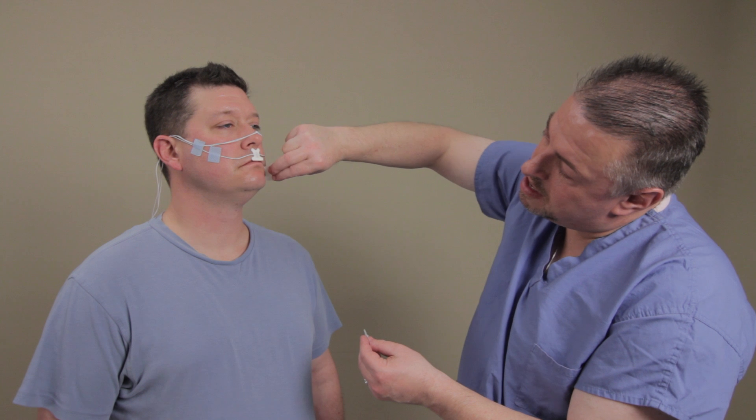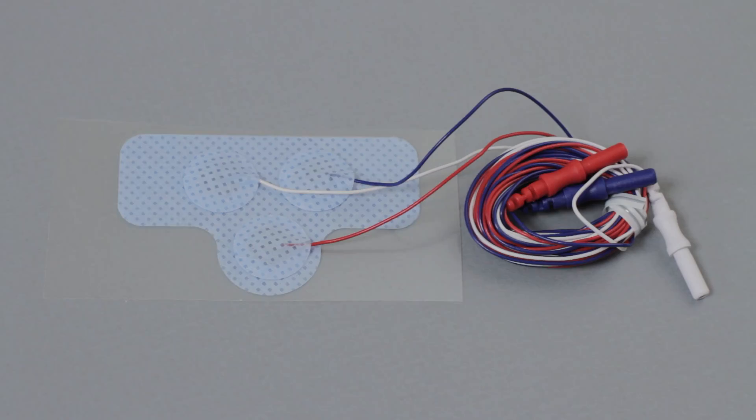As with all electrodes, proper prepping of the skin ensures good impedances. All three electrodes are pre-wired and pre-gelled for greater convenience and spaced one centimeter apart for low noise and to prevent bridging.